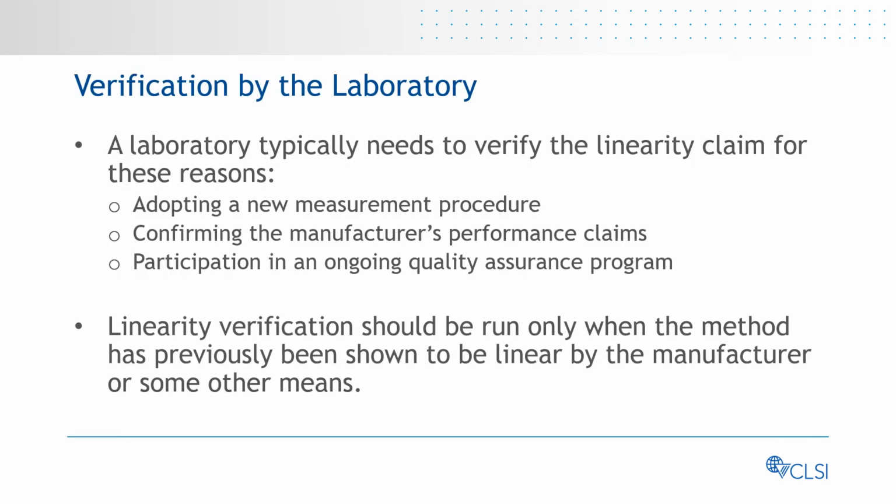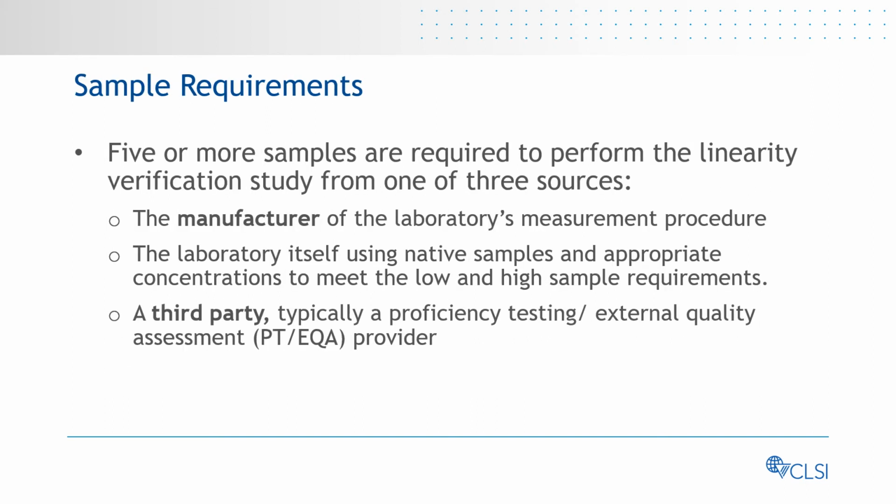Laboratories are required to verify the test developer's linearity claims for various reasons. Verification can only be done when the linearity interval claim has already been established. A simple study can be done using 5 or more samples.